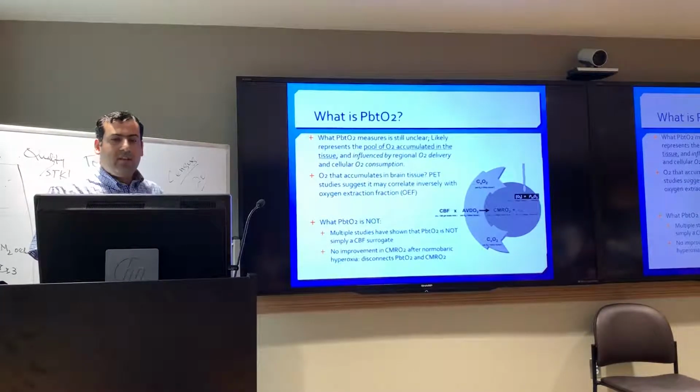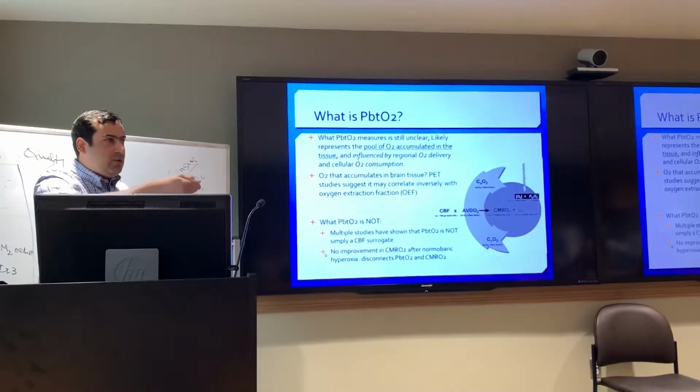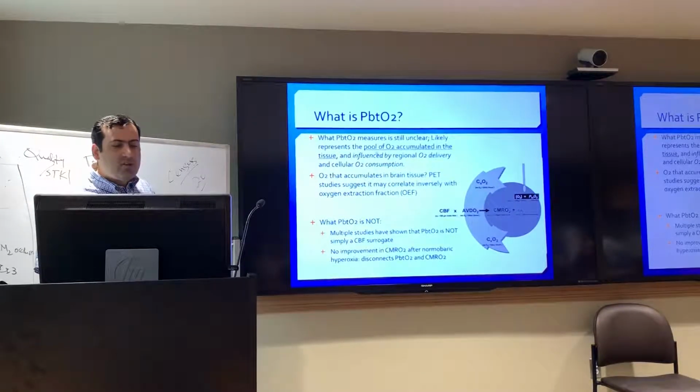So what is PbtO2? You put it there, and it gives you a number. What is that number? Well, it's still unclear. But what you can say is that it measures the pool of oxygen that is accumulated in the tissue, hence leftover food on the table. That is what PbO2 is. And after the fact, an external observer looking at the leftover food can't really say directly anything about the supply, use, hunger, quality, none of them.